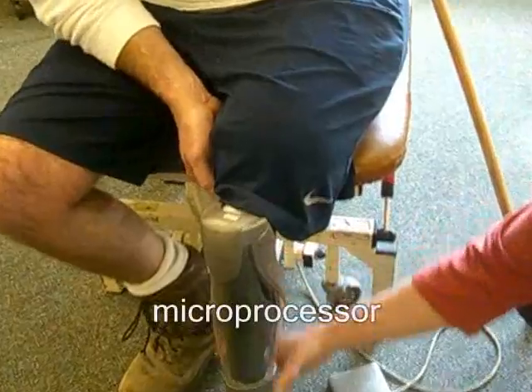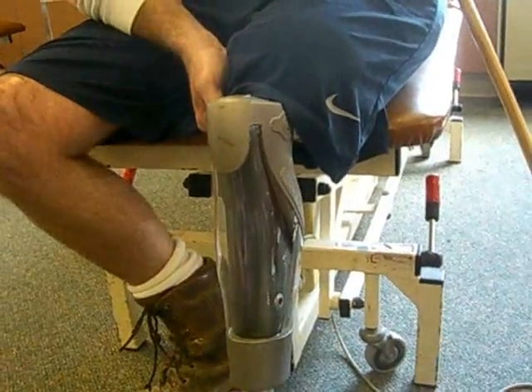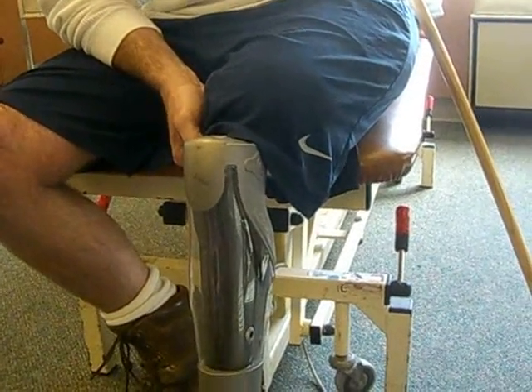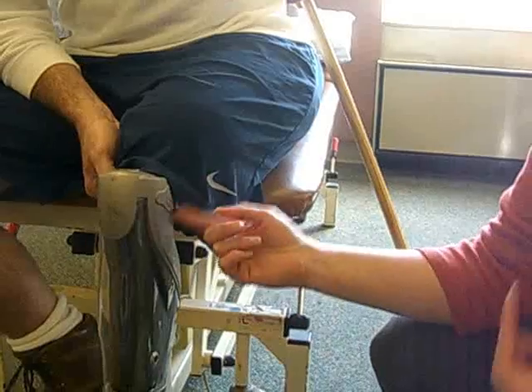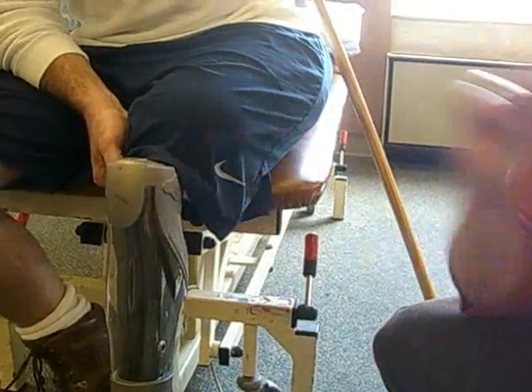There are sensors in this whole portion of it here that sense, number one, how much weight he's putting through the leg, but also the angle that it's at, so we can tell when he's in what's called stance, so he's putting his weight on it. As he comes forward and that angle changes, it gives the feedback to tell the knee what to do. Do we want it straight? Do we want it bent? How fast? It's a long process to get where we are today, but it's great to see him standing.